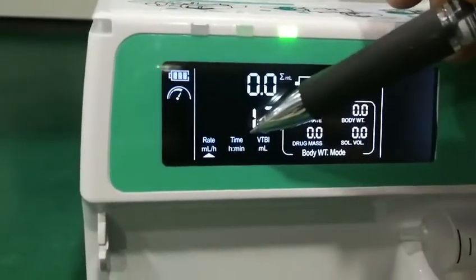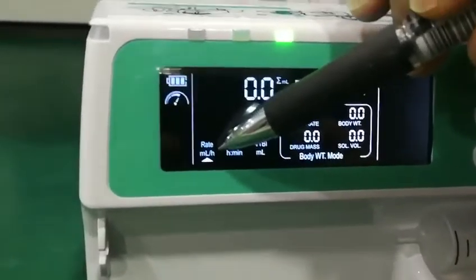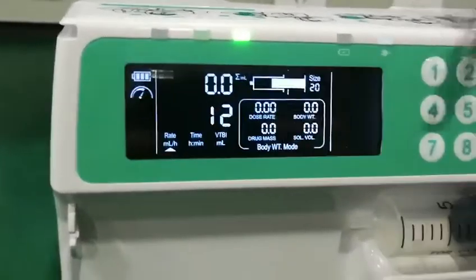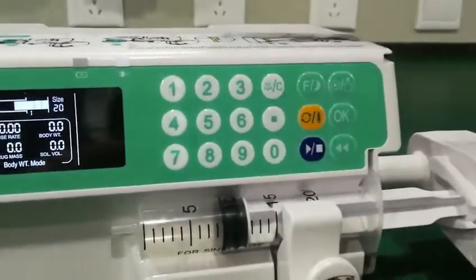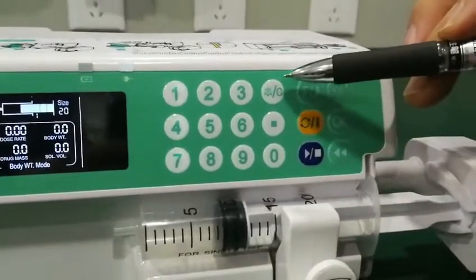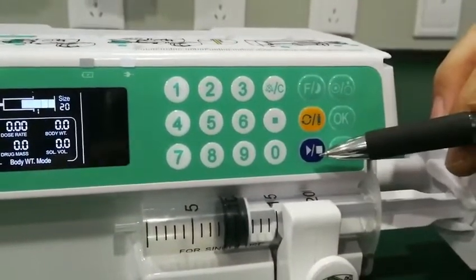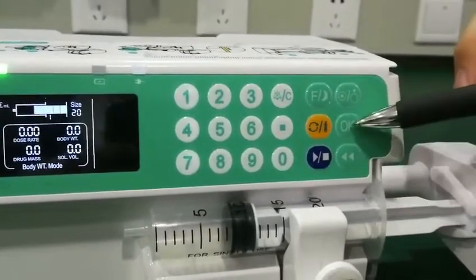Here is the time of infusion, here is the flow rate of the infusion, and here is the keypad to set the machine parameters. Here is alarm and clear, here is start and stop, and here is bolus.